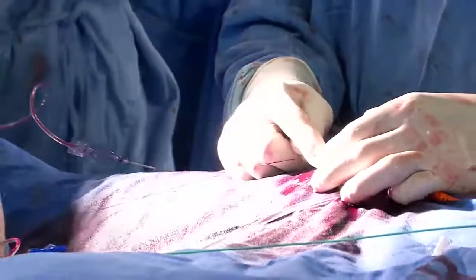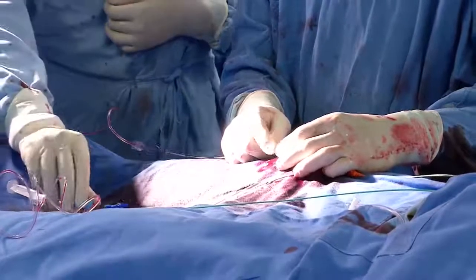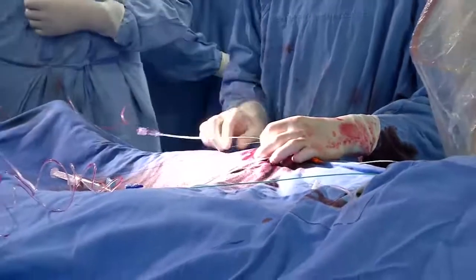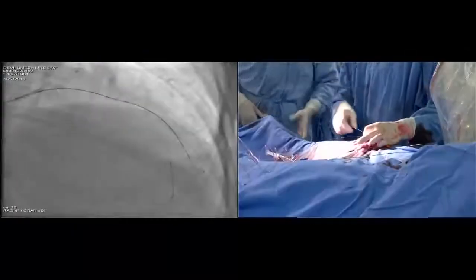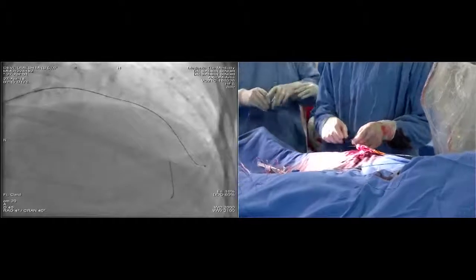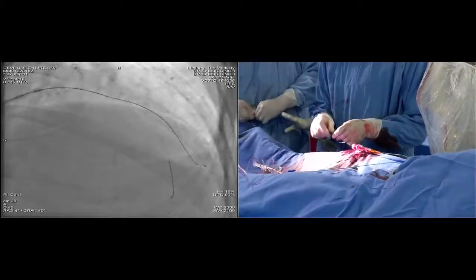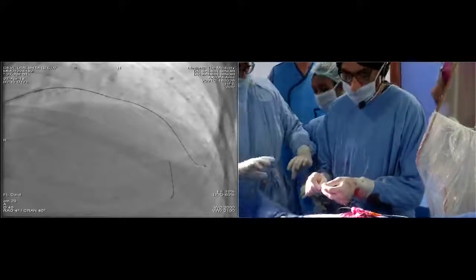Chalo, 6, 8, 10. 12. Down. OCT. And the diameter of the balloon and the length? What kind of balloon was it? The balloon was a 2.5 into 15. So it's a non-compliant 2.5 15 balloon.